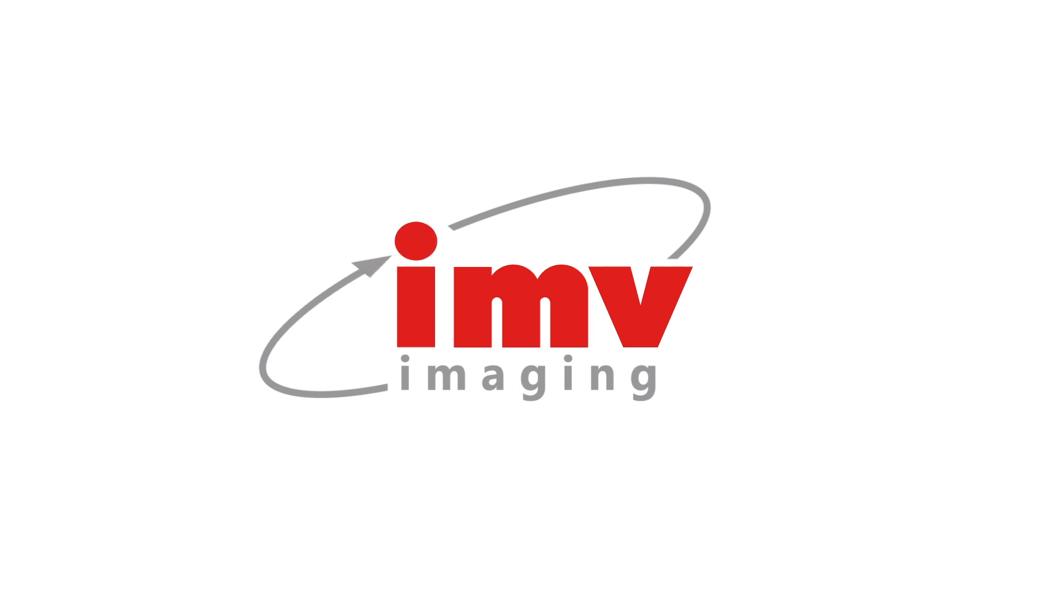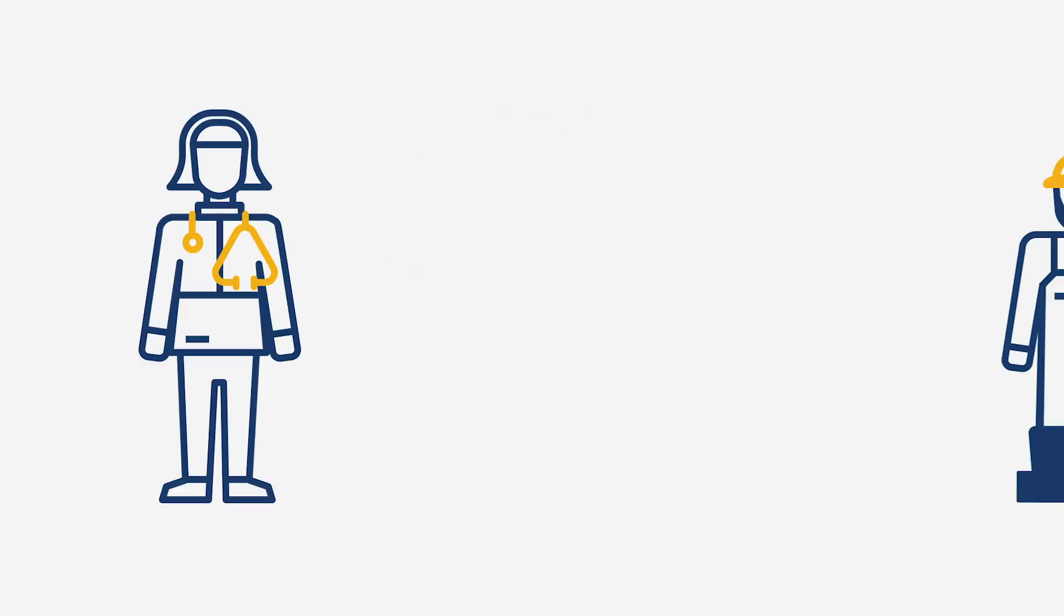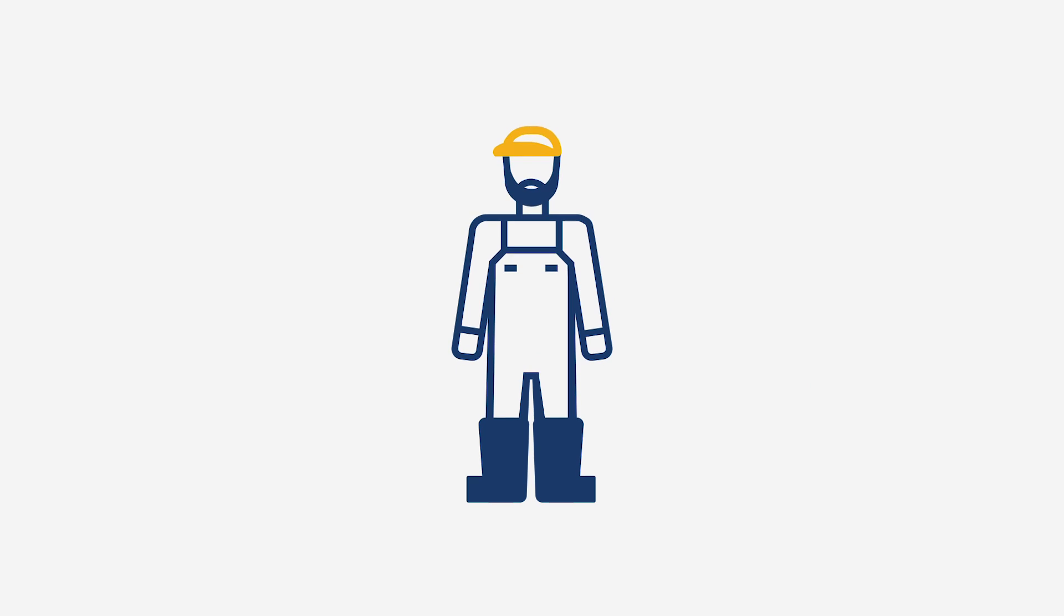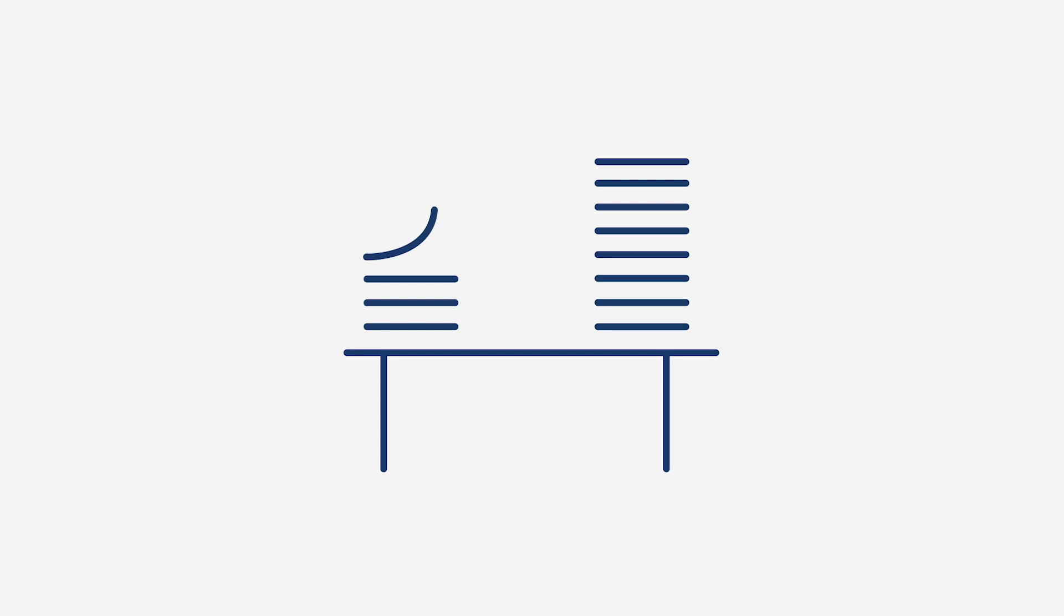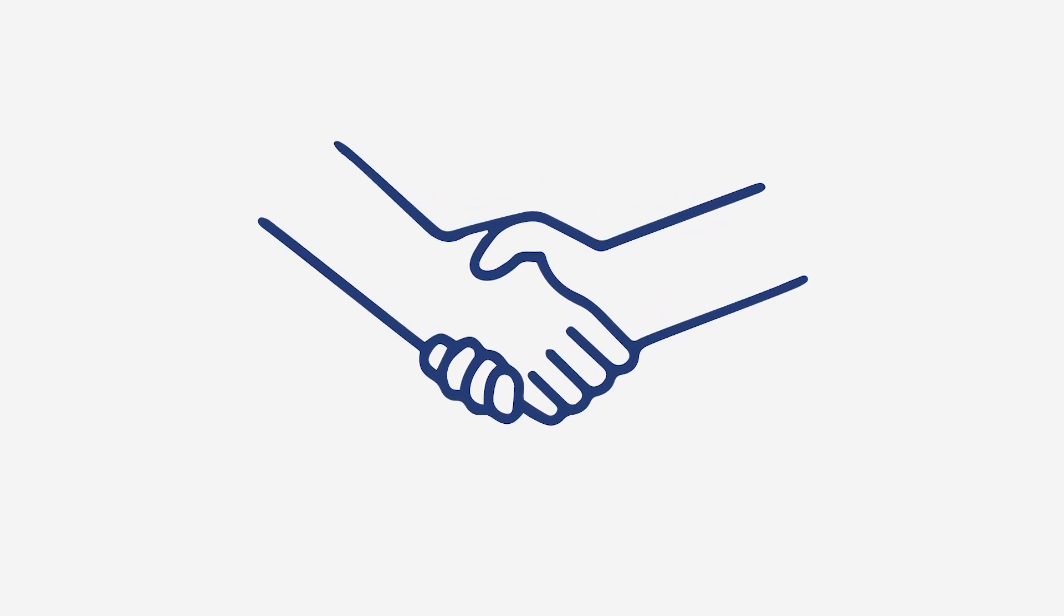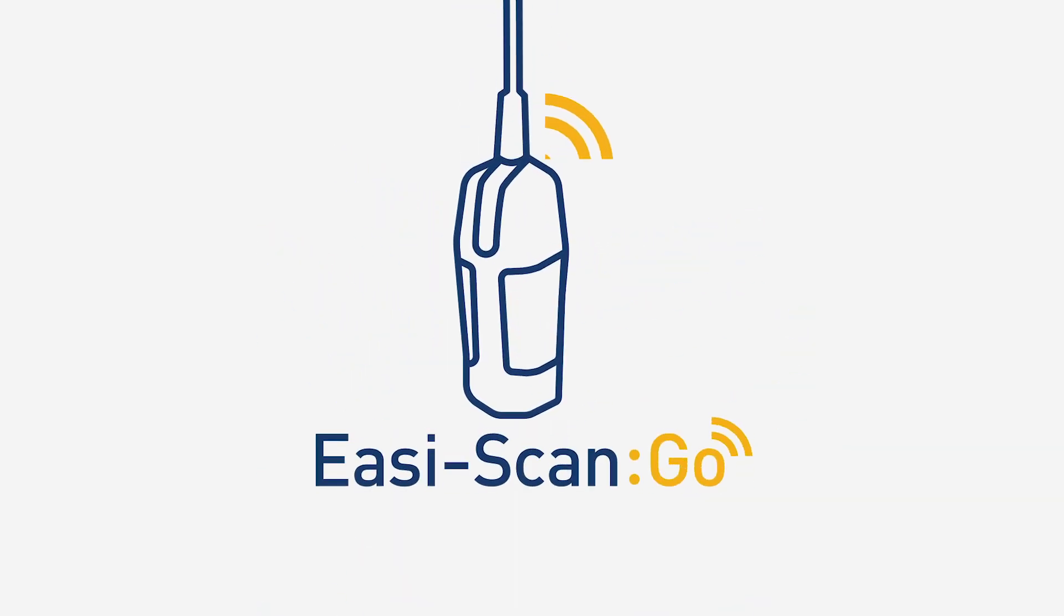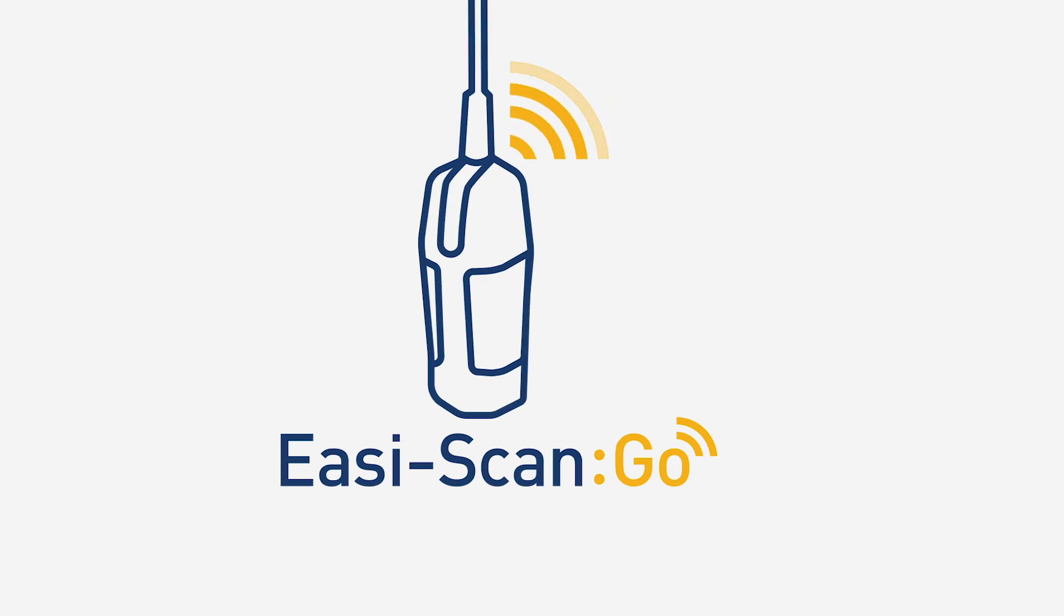At IMV we love working with vets and farmers. We know both are looking for efficient solutions to ease their busy workloads. Using our expertise in imaging technology, we want to strengthen that vital relationship. Introducing the new Easy Scan Go, the wireless ultrasound scanning solution designed for the 21st century farm.